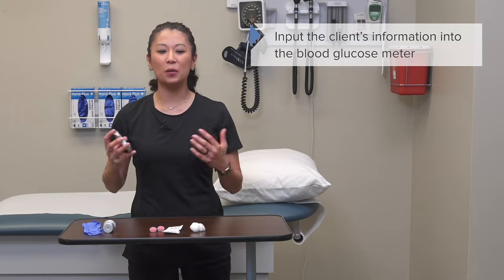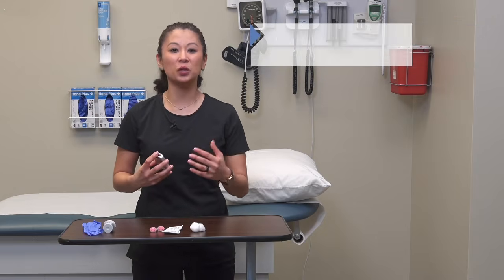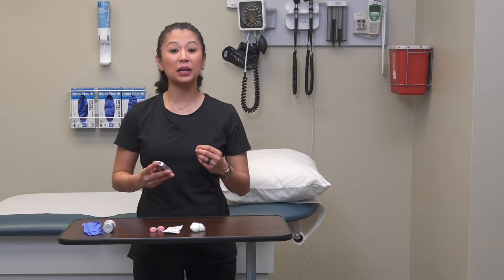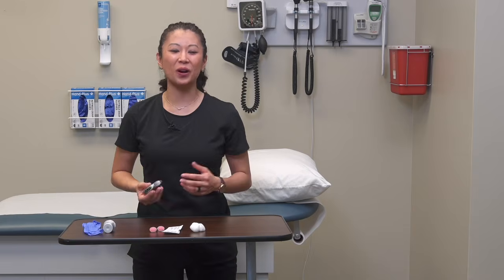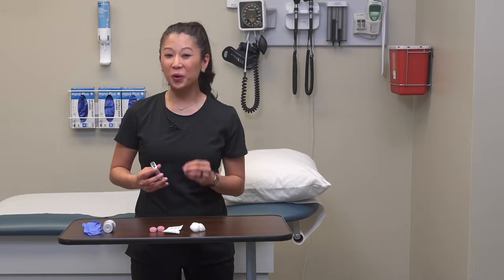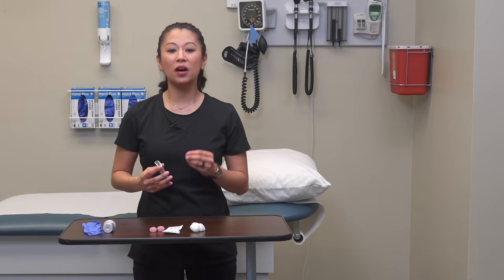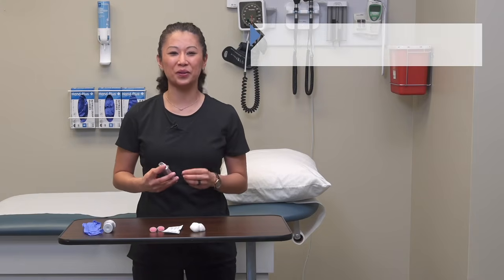And again, if I was at home, this wouldn't be a problem. But if we're using this in an acute care facility, we want to input the patient's data, and typically this is going to be by taking the meter and scanning the patient's bracelet. So that's going to make sure to upload the patient, but of course, make sure you as the provider or the healthcare personnel verify the two patient identifiers, the name and date of birth.